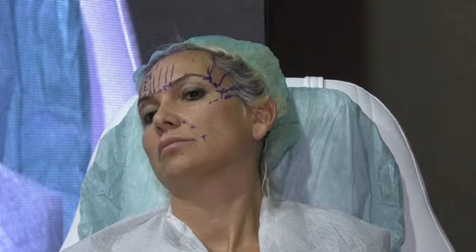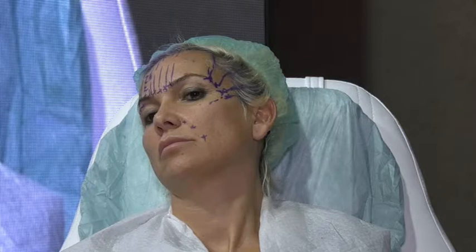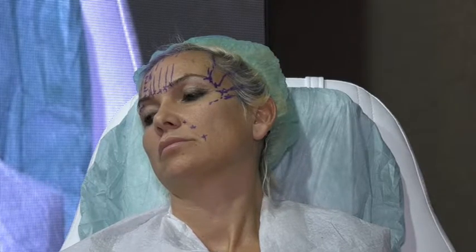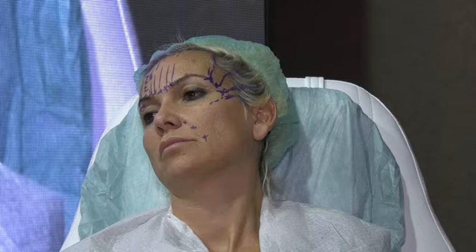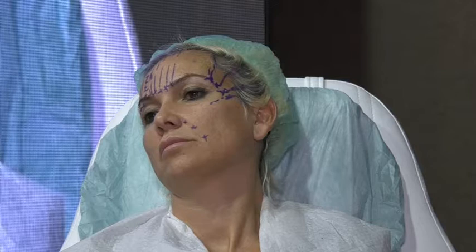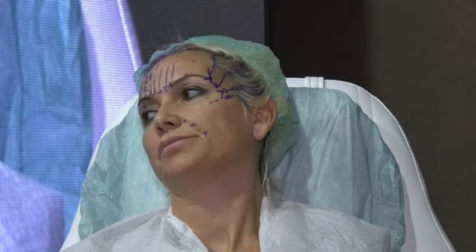To the temporal bone, exactly, I collect them to the temporal bone. Do we collect the threads in the temple? Yes. Why? Because we need volume, a volume contour. Some people tell me, no, I have a heavy cheek, or already have volume. You will be surprised that it looks much nicer when you do this kind of collection. Because when you have a heavy face and heavy cheeks, the volume is more anterior, here. But when you put the threads, the volume will go back toward your hair. So the face will look really different and nicer.